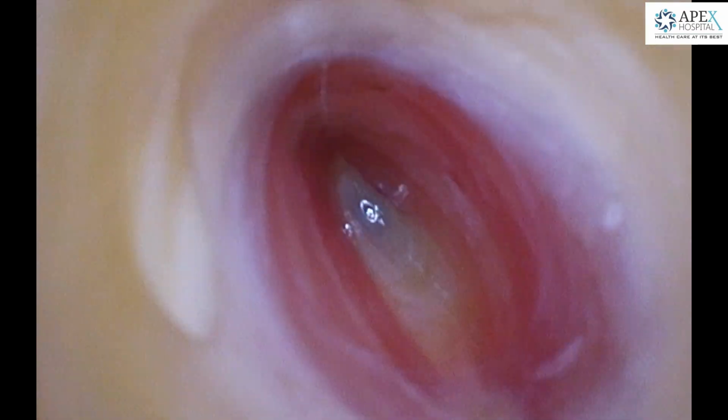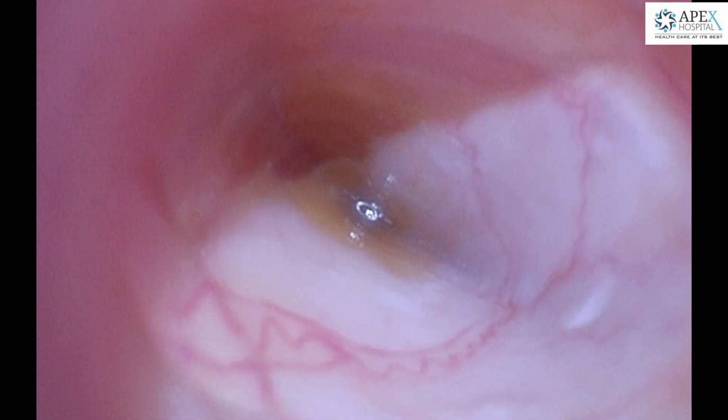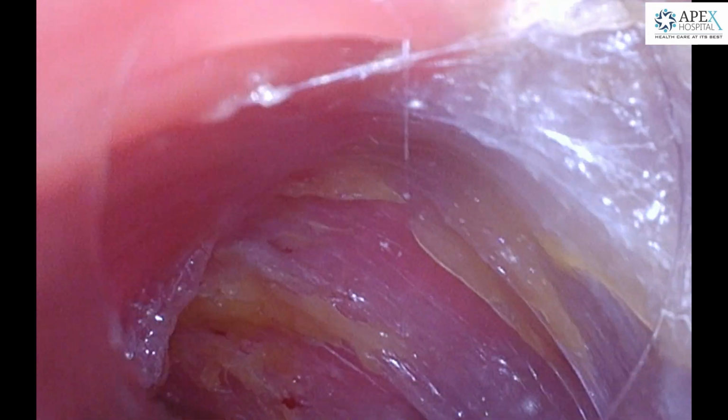The initial access for ETEP was made through the left hypochondrium using an optical trocar. The retrorectus space is being accessed here using the optical trocar, and once we are sure we are in the right space, insufflation has been started and further dissection done using the trocar.